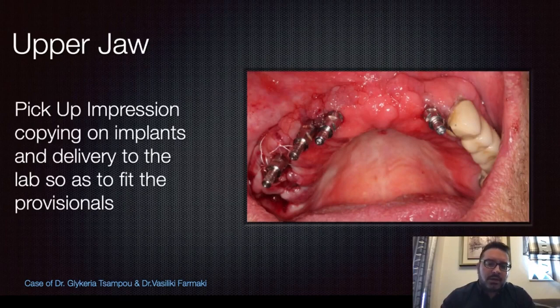Here are the clinical images after the implant placement. As you can see, the most damage was from the teeth extraction and not from placing the implants. Also in the position of 15th, 16th, there was a GBR technique for bone regeneration. These are the pickup open tray system impressions. It was sent to the lab.